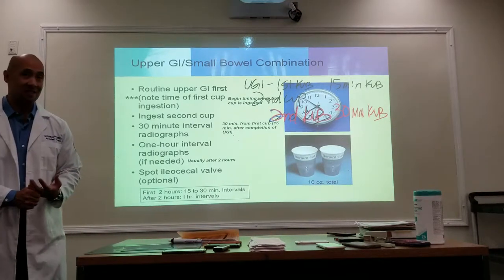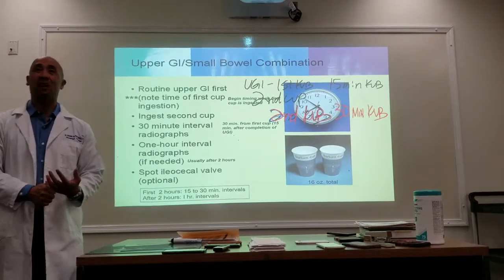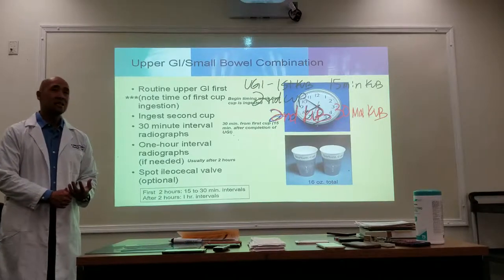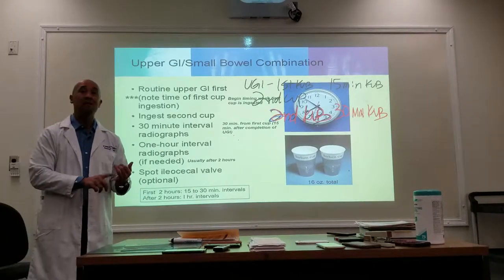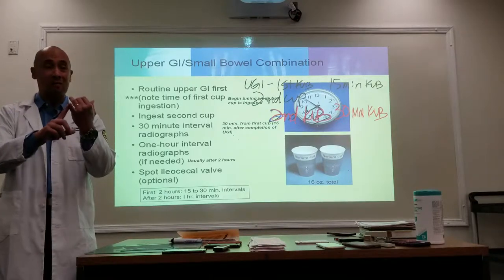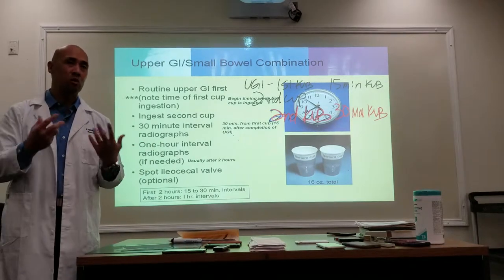But if there's an ileus, if there's some kind of obstruction, now it's going to take a long time for it to fill. An ileus is often called an obstruction, but an ileus can simply mean that the contrast is not moving around because there is no movement of the small bowel. So it's not a true obstruction per se.